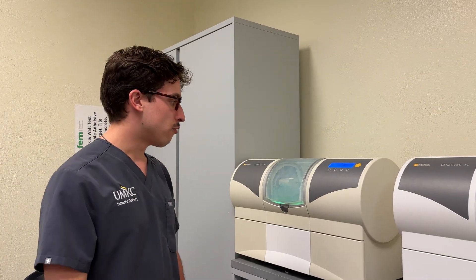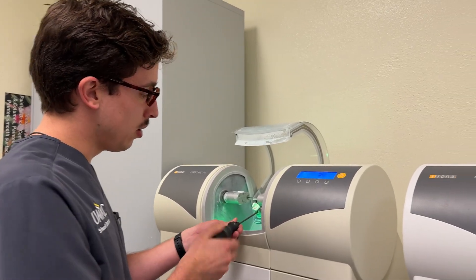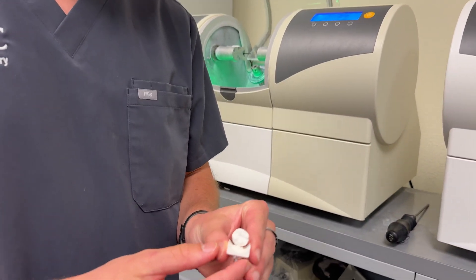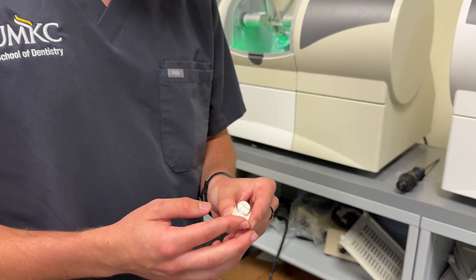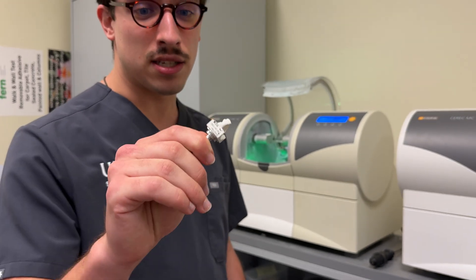Now that our crown has finished, we're going to remove it from the milling unit. Open it up, take our screwdriver, and unscrew it. This is what the crown looks like — a few things to note: first, the color and size are completely off. With zirconia, as we sinter it, it shrinks a certain percent, so to compensate, it mills larger so that after sintering it will be the correct size. Also, the shade looks nothing like the A2 we selected, but don't be alarmed — within the sintering process it will both shrink and turn into the selected color.